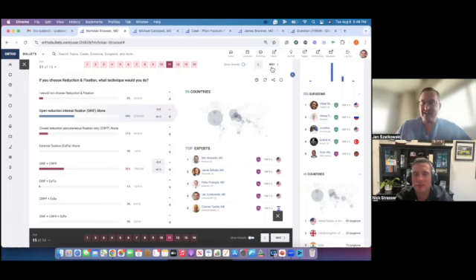Is there a staple option? Did anybody select that? Because that's the one question I have. Nobody said that. I've heard some people talk about using staples for ORIF of the midfoot, and the whole idea of that is to provide continuous compression, and maybe stability, but it seems a little counterintuitive when you're talking about bridge plating or bridge fixation across the joint surface.